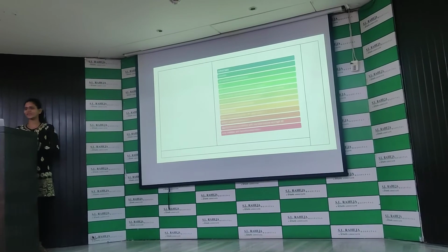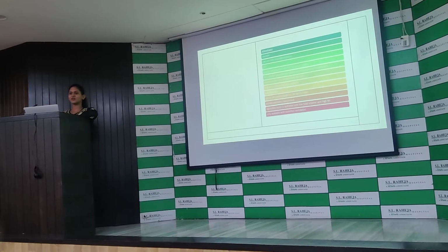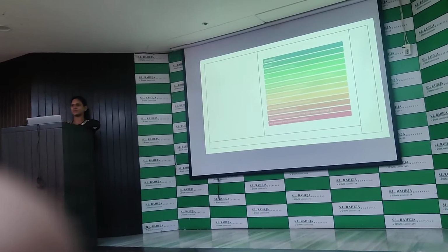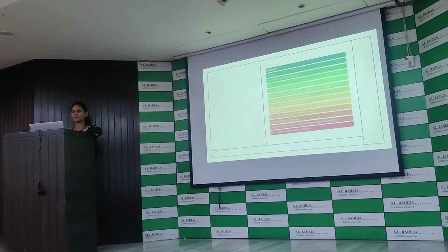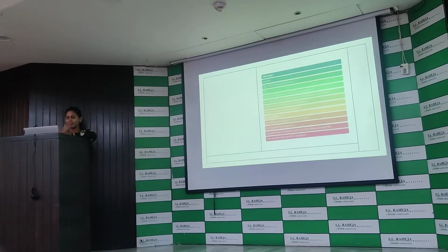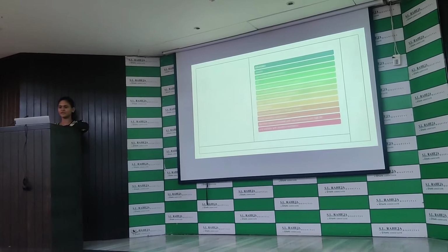So the advantages are that it's versatile. It can ventilate any patient and do it in a safe manner. It prevents tachypnea, auto-PEEP and dead space, like it will always keep it in the box. It is less operator dependent, with less need for operator involvement. It decreases the time on mechanical ventilation and adjusts to the patient according to their inspiratory effort.